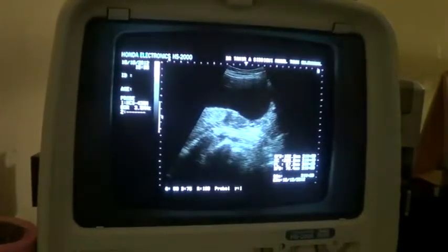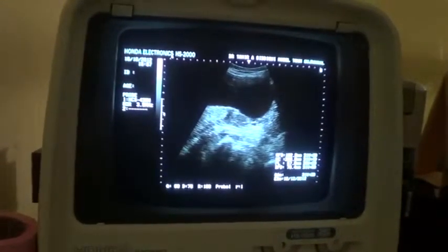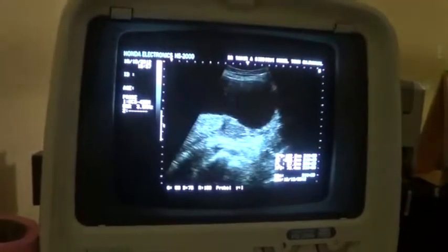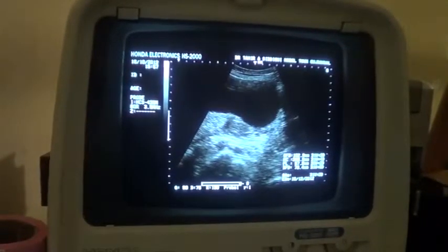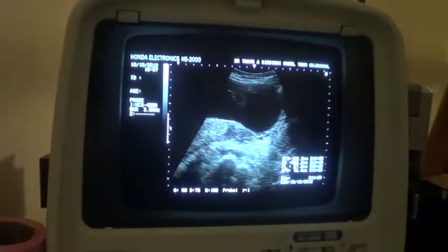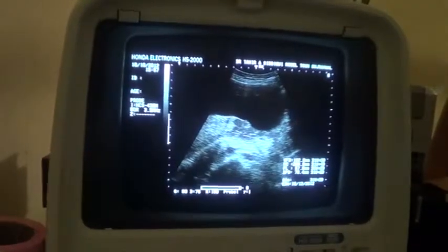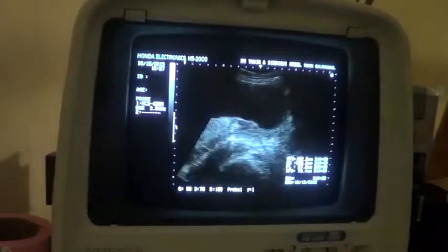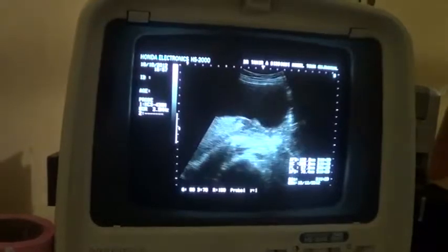This is a female obstetric ultrasound referred for large dates and to rule out any fetal anomaly. She has 2 kids who are normal. No history of cesarean.